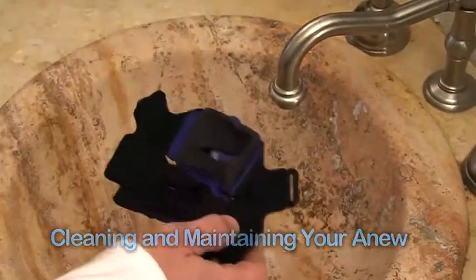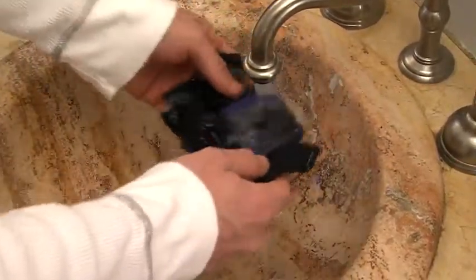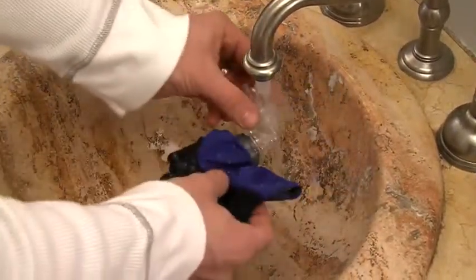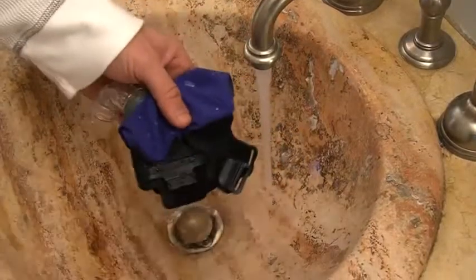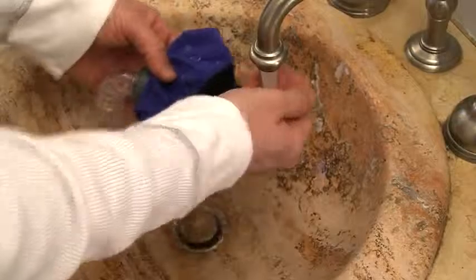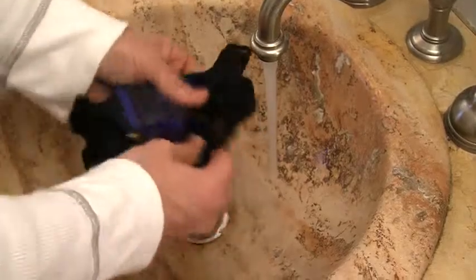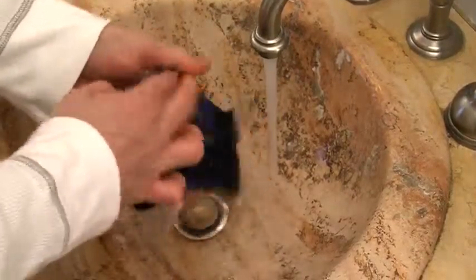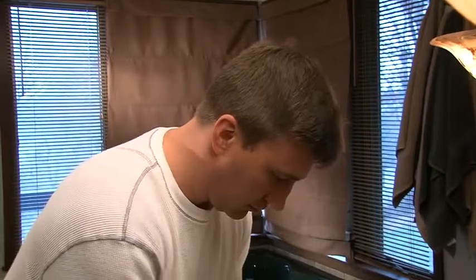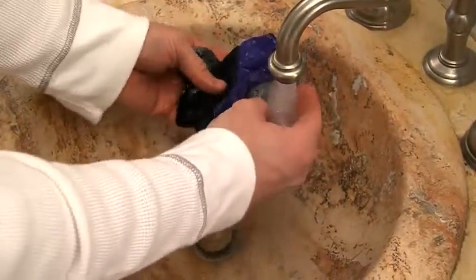It is recommended that your SleepWeaver Anew be cleaned by hand washing with a mild, non-abrasive soap in warm water after each use. Never use hot water. You may keep the 90-degree elbow AAV swivel attached during cleaning, or you may remove it and clean separately. Repeat washing until it is visibly clean, then rinse well with drinking-quality water and allow to dry.